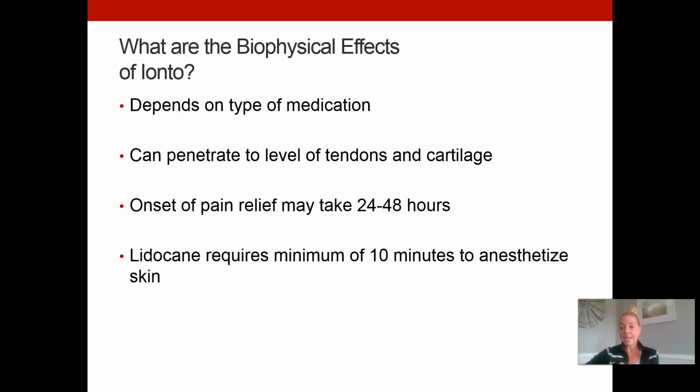If you are using lidocaine to try to anesthetize the skin, it's going to take a minimum of 10 minutes for that to happen. But again, that's clinically not typically what we're using Ionto for.